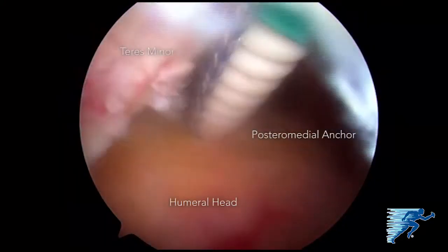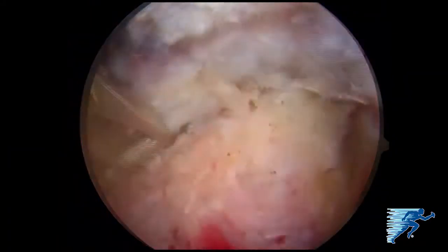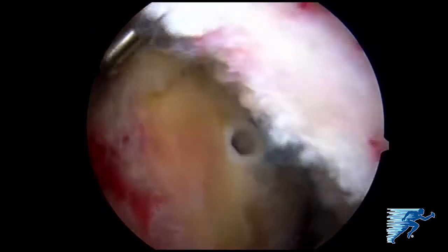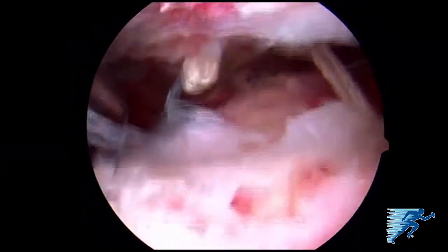The posterior medial anchor is placed. It's important to pass your sutures just lateral to the muscle-tendon junction to avoid any damage. We then place the additional two medial anchors. At this point we have eight strands of fiber tape suture.